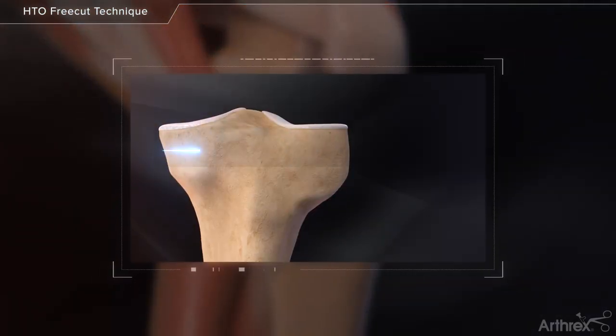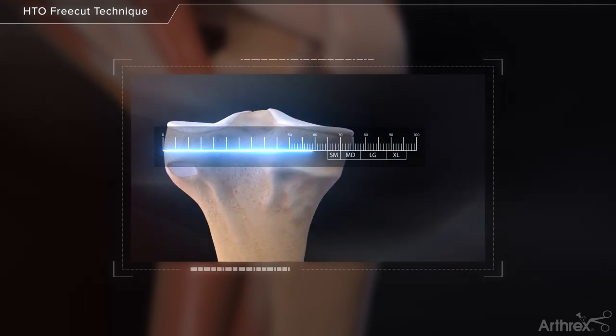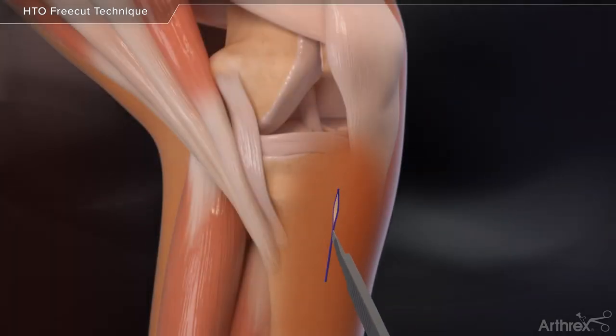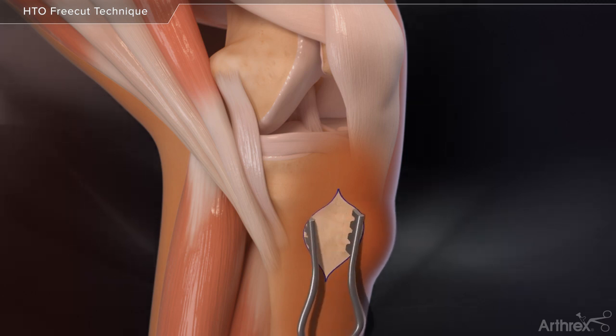Assess the ML size of the tibia to ensure the appropriate selection of implant size in the conventional i-Balance HTO manner. Make a standard skin incision and approach the conventional high tibial osteotomy as described in the i-Balance HTO surgical technique guide.